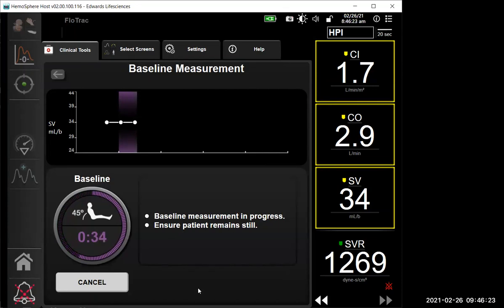So you can do a passive leg raise, or you can give a 200 cc bolus quickly, so over 5 minutes ideally. So either pressure bag or a really good central line. Should be good if it's in within 10 as well. But if you don't have that 10% increase, more fluid isn't going to help. So say they order a liter, you would have known in 200 whether it's going to help. So we don't over resuscitate our patient or drown them. We don't like to do that.